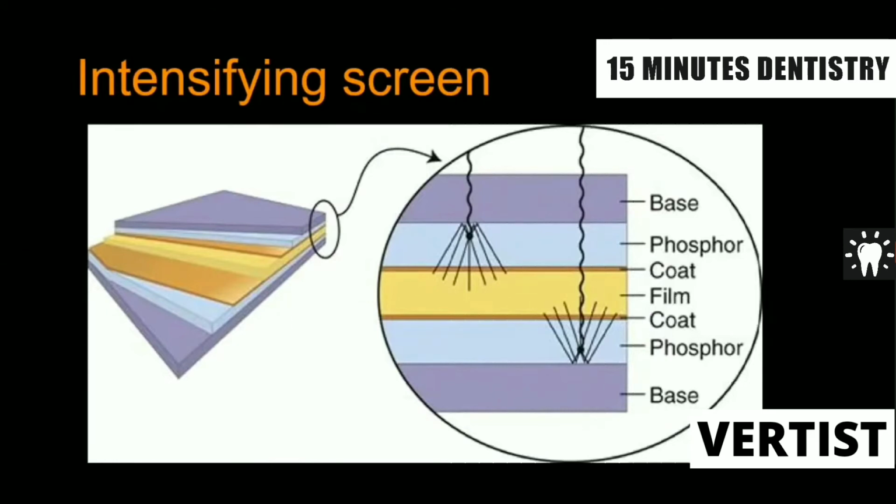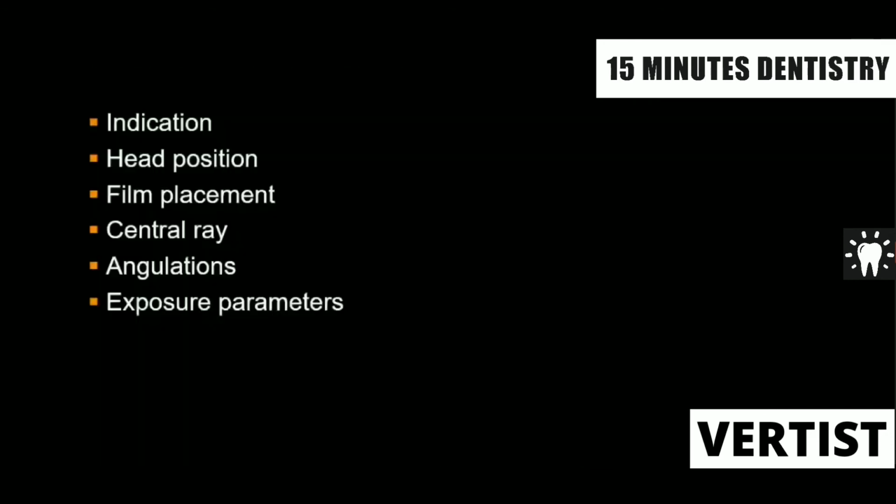On both the sides there will be the intensifying screen, and inside that the film, the extraoral radiograph that we are going to see in the coming slides.